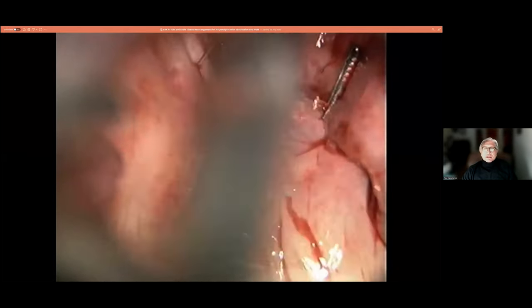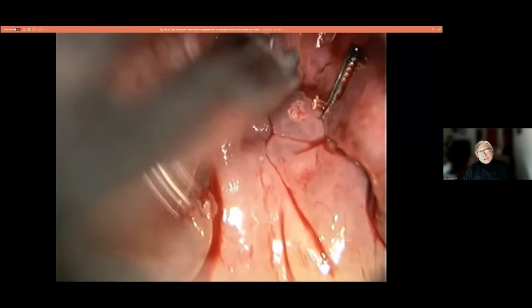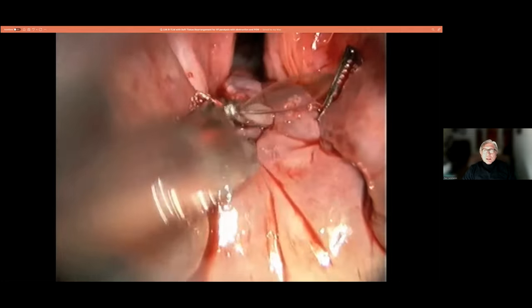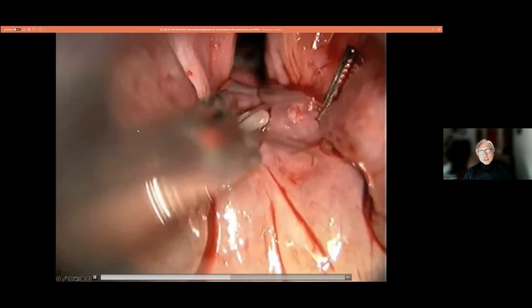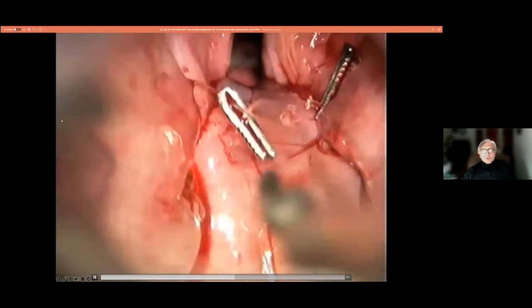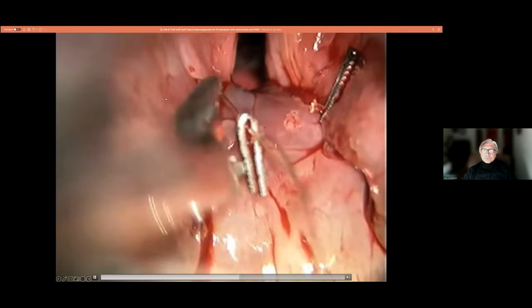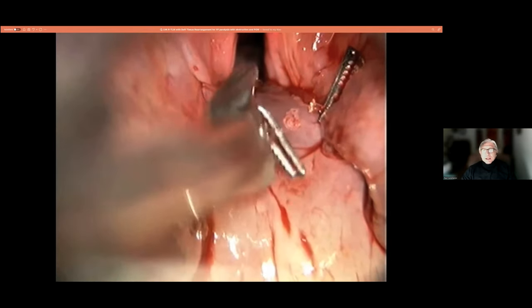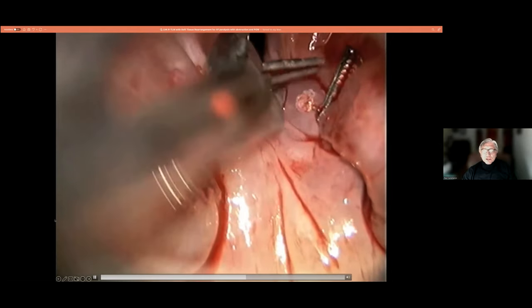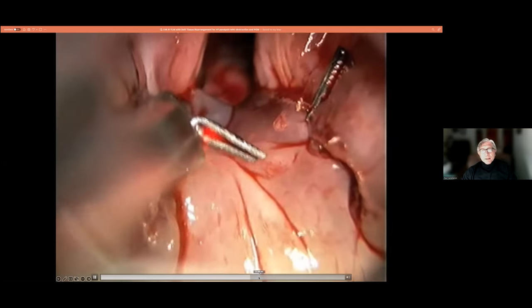in the patient's larynx. And then you take the clip plier. Now I'm gonna show you a problem with the clip plier. So you might think, okay, that's not the thing to learn. Well, it is the thing to learn, because you can see, even if you have a problem, in this case, I've actually attached the clip to some tissue, you can correct it. And if in correcting it, you've rendered the suture too loose, well, then you can simply clip underneath that. Same way, just get underneath, clip it again. And then at the end, after you've laid your clips in good position, you can use the laser to cut the excess suture material away.